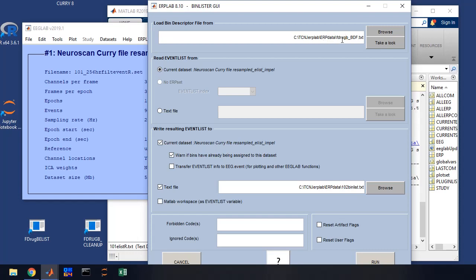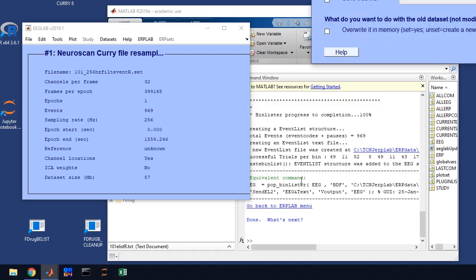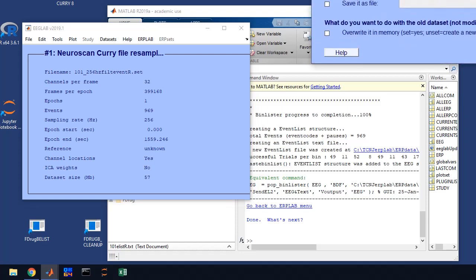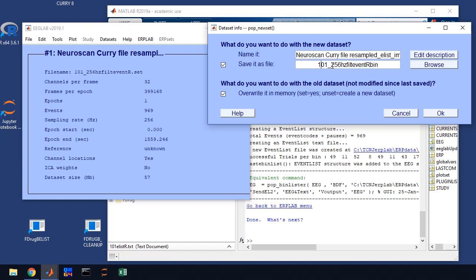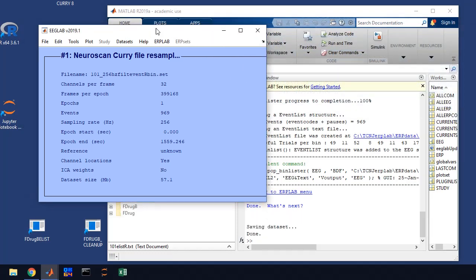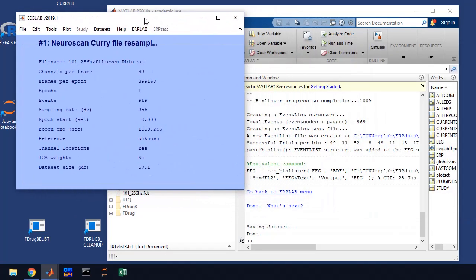All you'll have to do, this should be populated. All you'll have to do is check and make sure that's the right file, the right bin lister file. If not, you would select it. Again, this is in the protocol. And the only thing that you'll change is down here in the text file. For each subject, we create its own bin list output just so we can go back to examine it if we need to. And we'll click run and it's going to create that bin list file and it's going to attach it to our EEG. But we're going to save it and I'll show you that file gets created. Now it's been binned. So we add bin to the file name and you're going to click OK. And you'll notice that this bin list data file has been now created. So it's been binned.